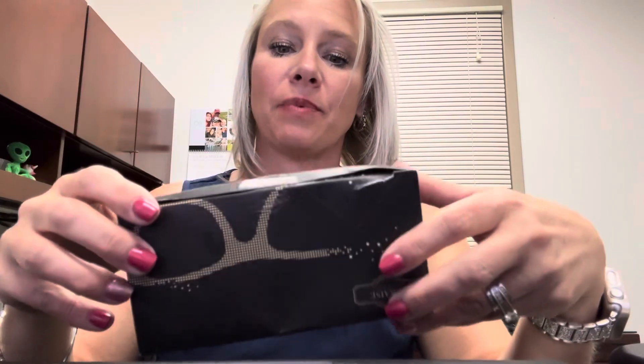I want to show you guys this pack of reading glasses that I got. This one comes in a pack of four. They come with a lens cleaner. They do come in different strengths, so you can find the strength that you want.